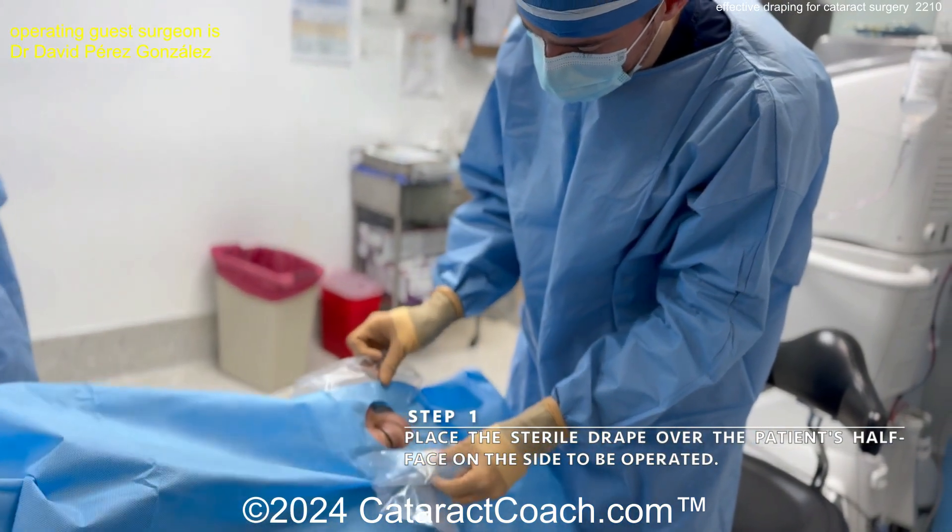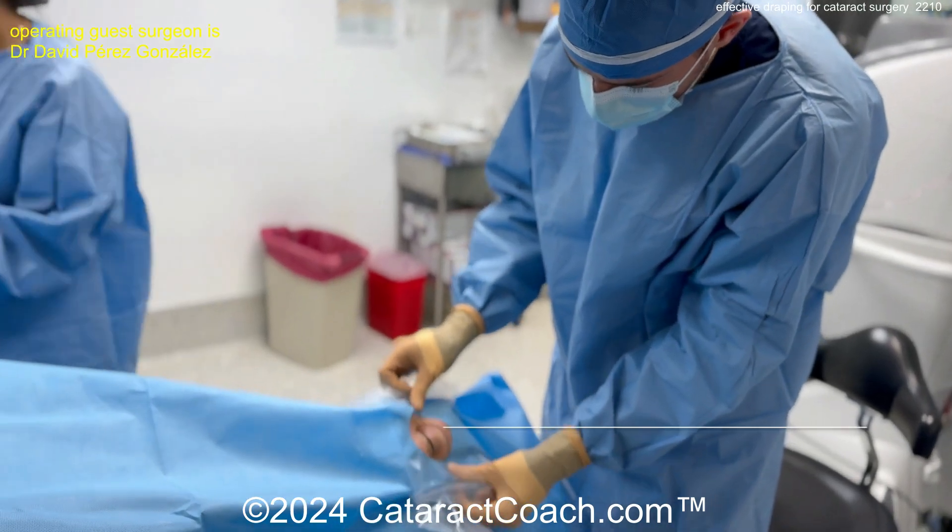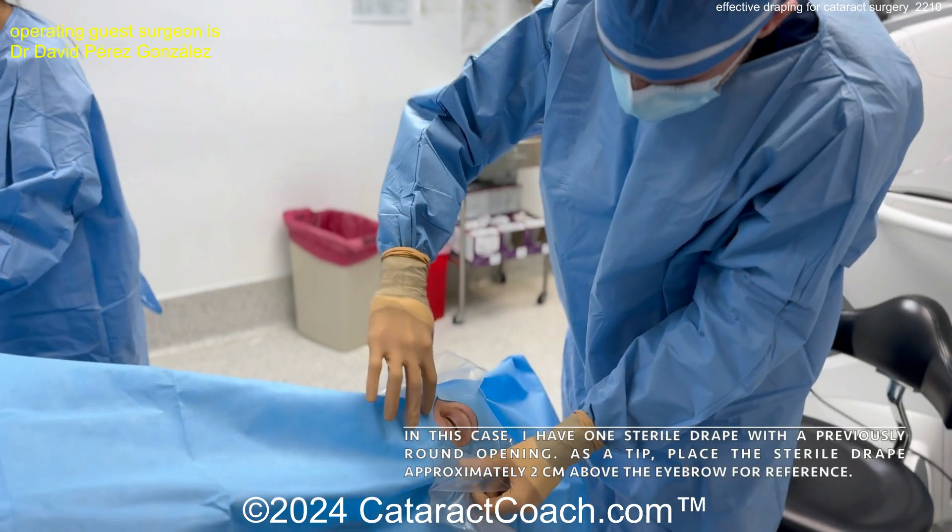Just the eyes are exposed, and here are the side pockets to help catch any fluid. Notice how the surgeon is not touching the patient's skin at all.